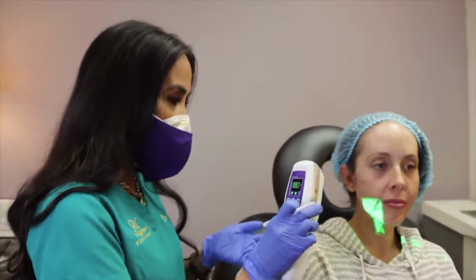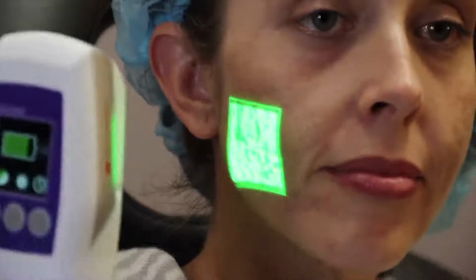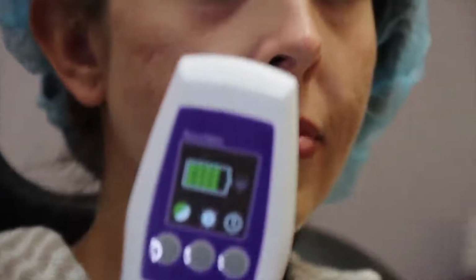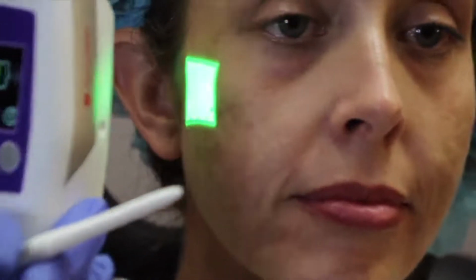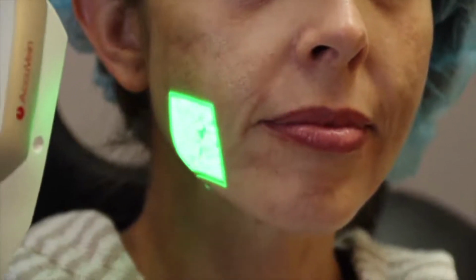We also care that we decrease your downtime, so we try to minimize bruising and also obviously make the procedure safe. So this is the AccuVein, and this is a tool that we use. This is infrared, and you can see these lines, dark lines here, are blood vessels. And we really want to avoid hitting the blood vessels, because when you do, the patient will have more bruising, and obviously also you can have major complications if the filler ends up being in these vessels, and it can create a lot of major problems, so we want to try to avoid it.